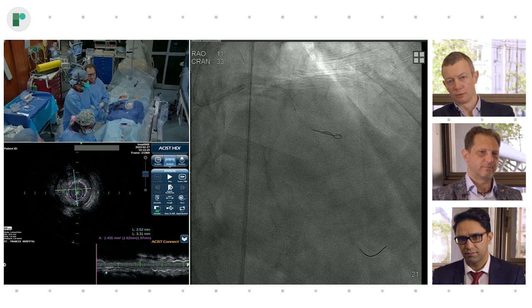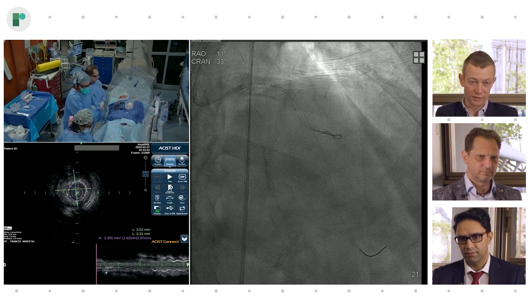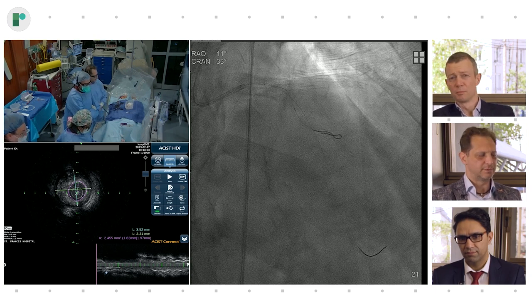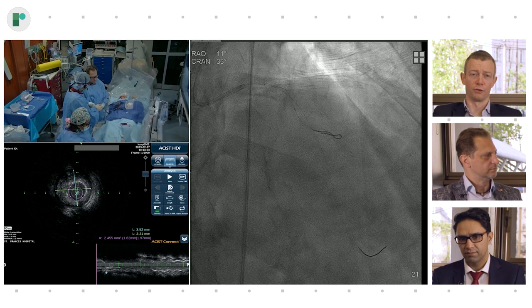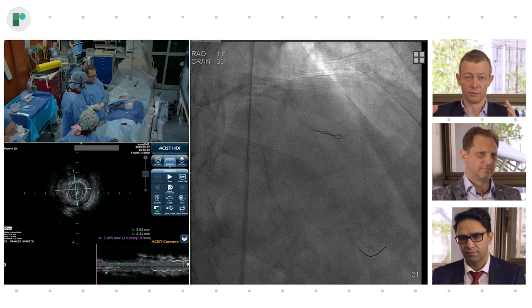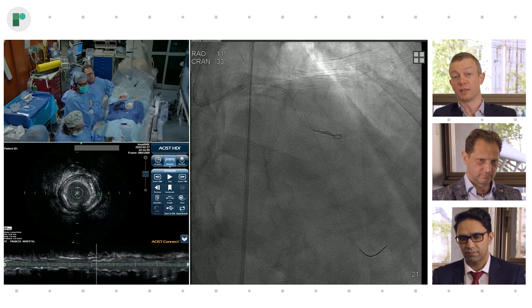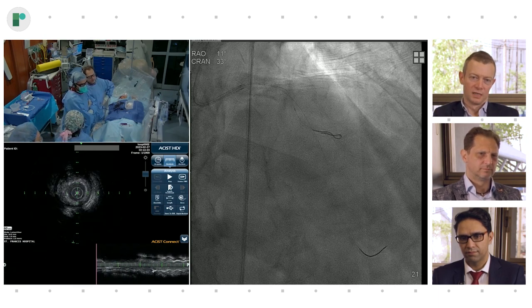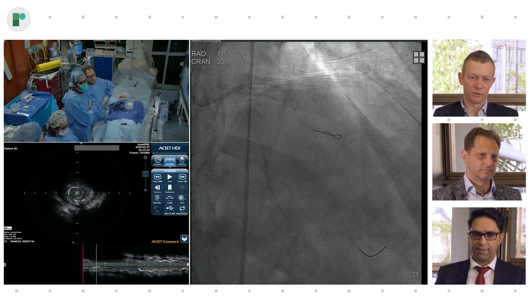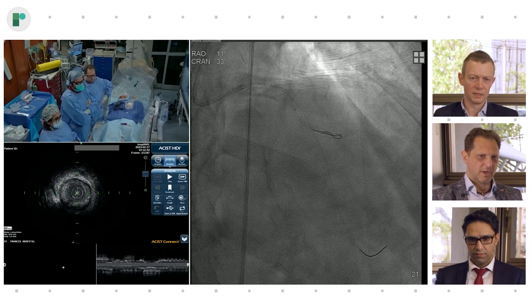Yeah, but in this case, I think you're right. Identifying the true vessel sizes on this occasion is extremely difficult. You find a lumen diameter of, what was it, 1.7 times 1.9. It's really small, but there's a lot of plaque. So you have positive remodeling, so you overestimate the vessel size. But you also have a lot of plaque burden, which makes you simply not able to do proper sizing based on what you think should be the precise and actual vessel diameter. So it's difficult. But here you're scrolling around, right? So you have here 1.9, 1.7, small. This lead is a lot bigger.